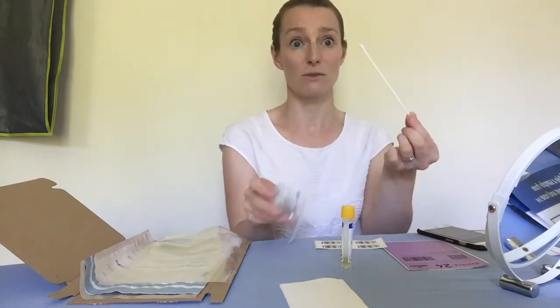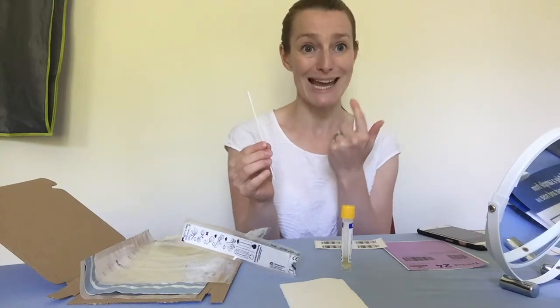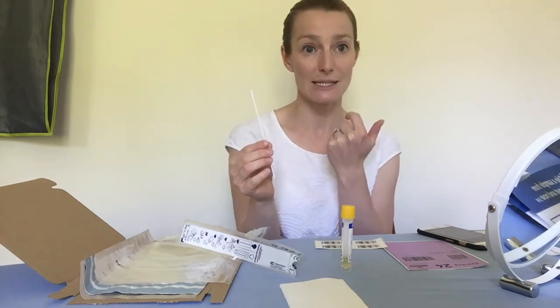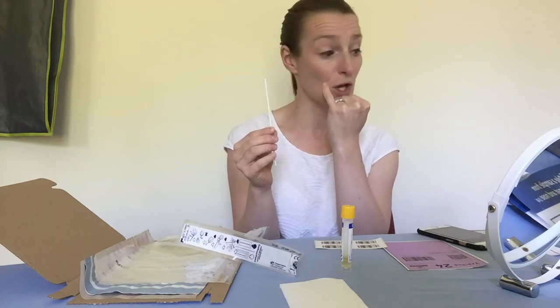This is the swab. Make sure you don't touch the other end of the swab. You're going to swab your throat for 10 seconds — that's rubbing the swab over both tonsils for 10 seconds. Then you're going to use the same swab and put it up into your nose.